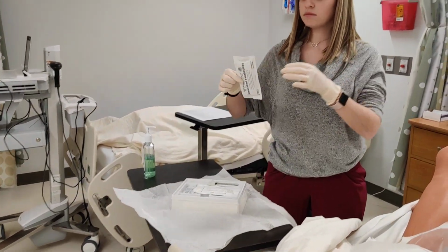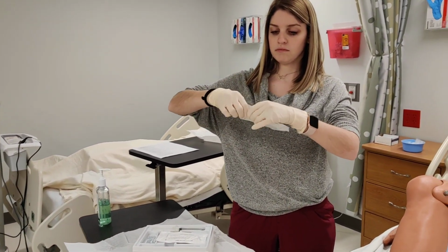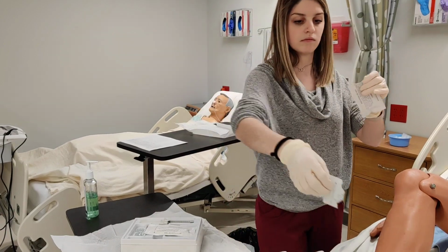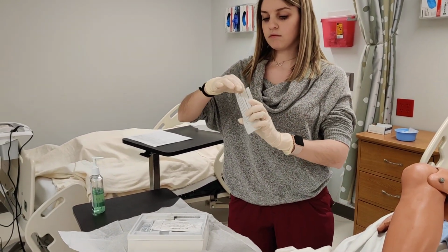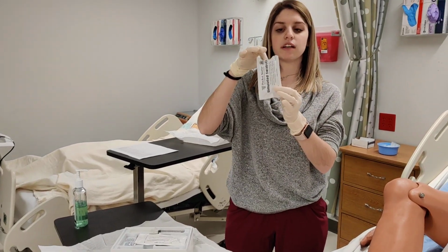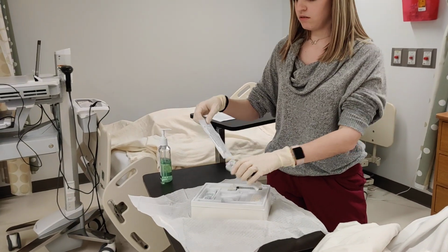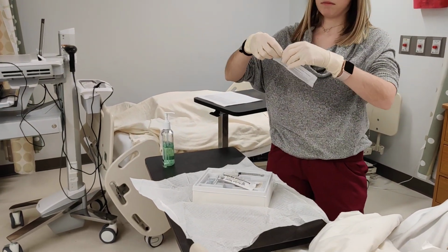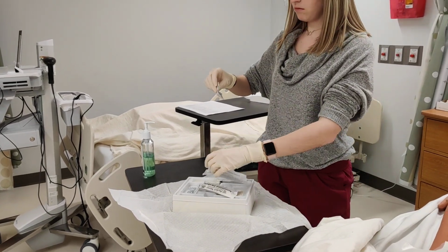Once she's done that, inside the kit are some swab sticks. They will be pre-treated with betadine. These ones are clear, guys, because they're simulated, so you won't actually see the betadine. Okay. She's opening the packages up. This is preparing the supplies ahead of time.